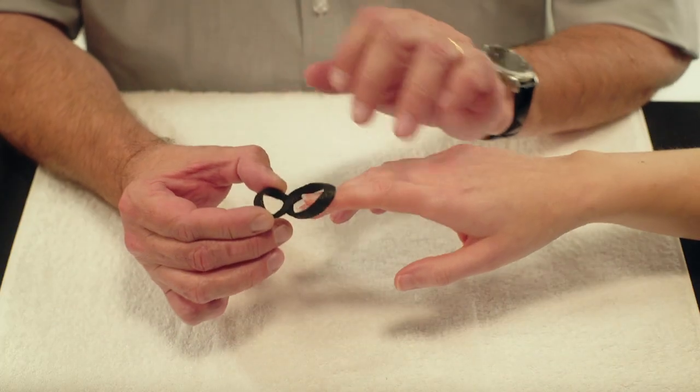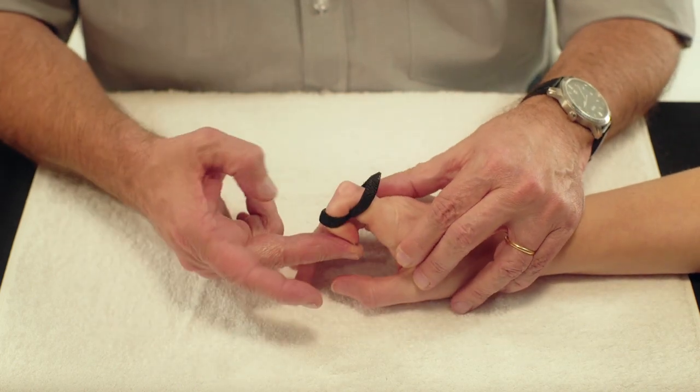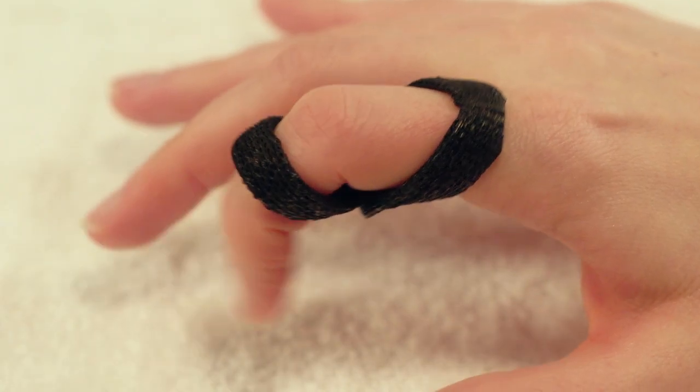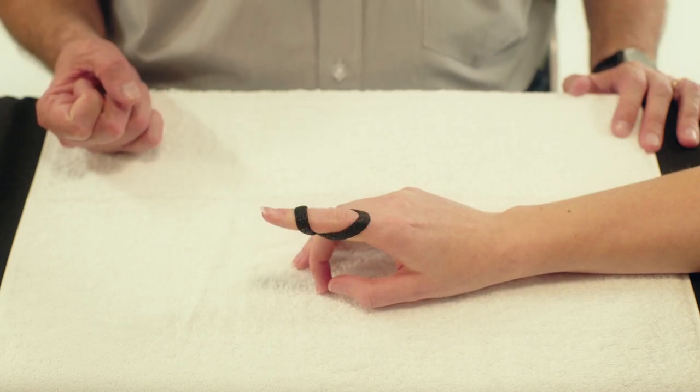The orthosis can now be fitted to the patient's finger. The orthosis will allow full flexion but prevent hyperextension of the PIP joint.